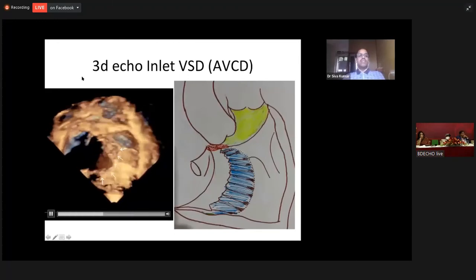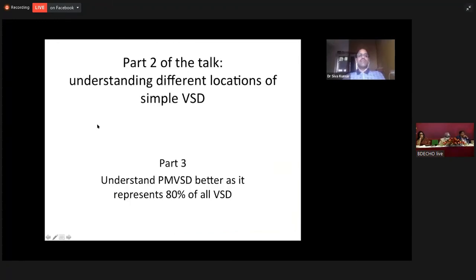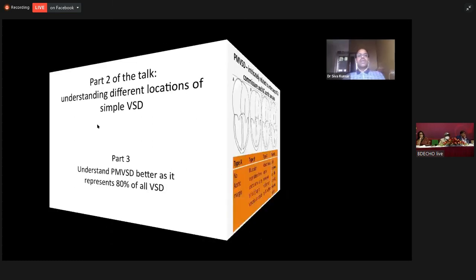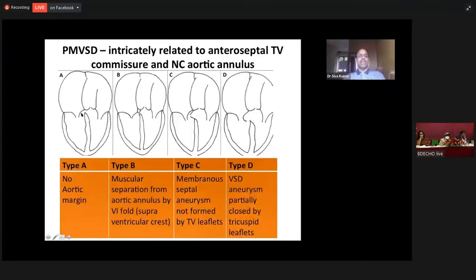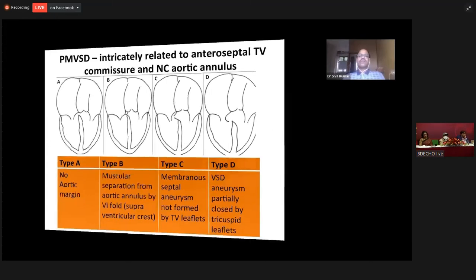Having seen the different forms of ventricular septal defect, the last part will be perimembranous VSD — the commonest form. Perimembranous VSD can be classified as type A when there is no aortic margin, type B when there is a muscular aortic margin, type C when it forms a membranous septal aneurysm, and type D where the septal aneurysm is formed by the septal tricuspid leaflet itself. Here the septal tricuspid leaflet is not forming the aneurysm — here the tricuspid leaflet is forming the aneurysm.